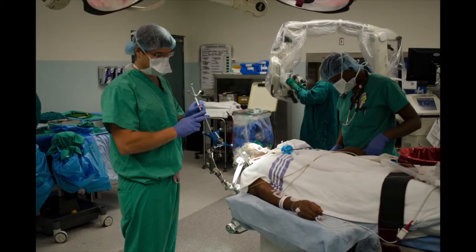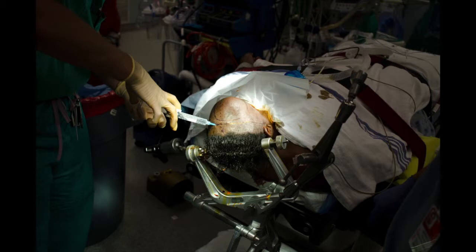If stereotactic navigation is used, in this case frameless, then registration is done at this time. The surgical region is minimally shaved and the skin incision is marked from zygoma to zygoma along the coronal suture. Depending on specific case characteristics, a modified bicoronal incision may be performed, limited to the superior temporal line on the side contralateral to the lesion.